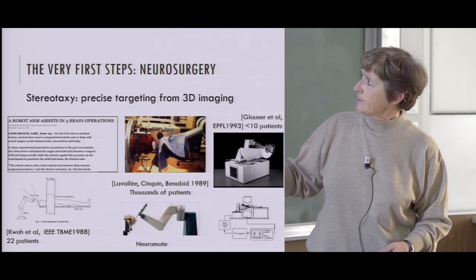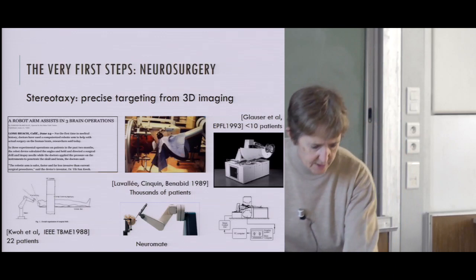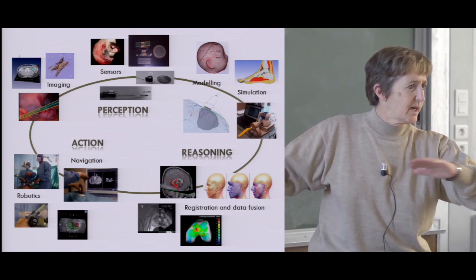Excuse me, what is CT? Scanner, computed tomography. It means by X-ray? Yeah, it's X-ray. So the 3D, this kind of image like that. You get slices of the patient, okay? Based on X-rays.